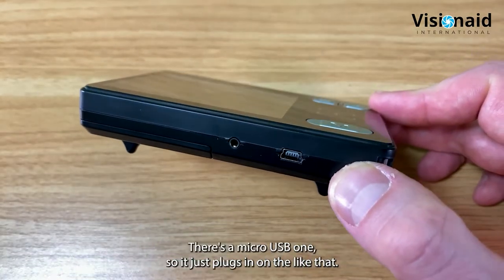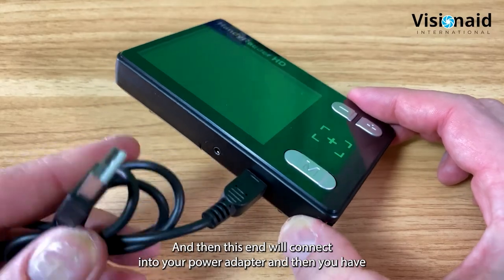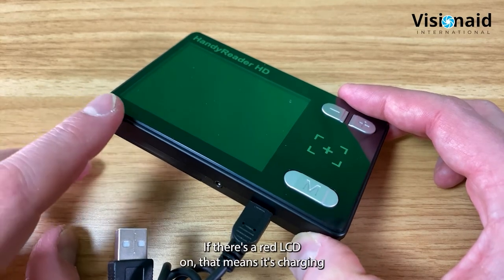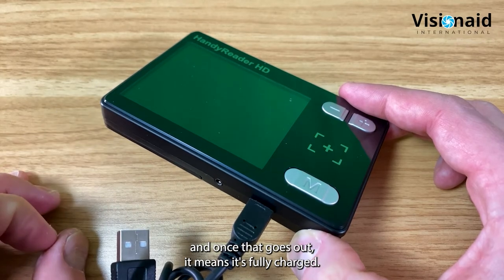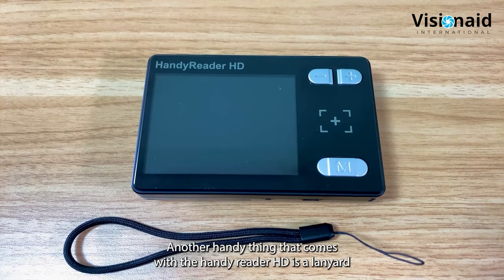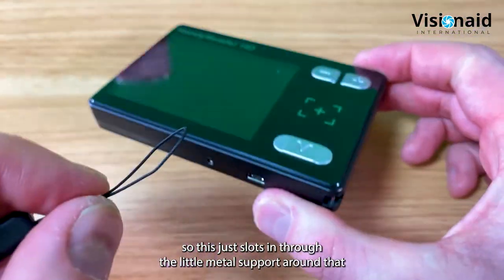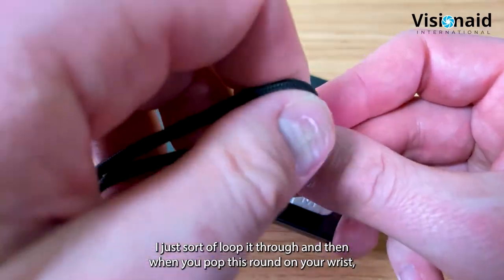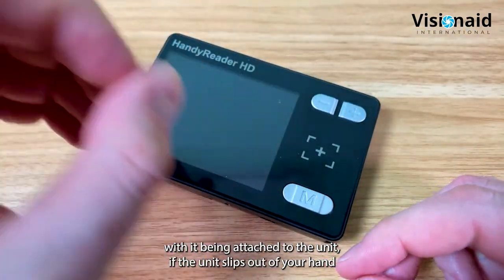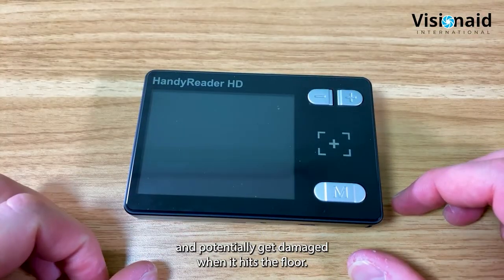The charging port on the bottom is a micro-USB connector. The included power adapter connects to the other end. LEDs on the bottom left corner indicate charging status - red LED means it's charging, and when it goes out the unit is fully charged. The lanyard slots through a little metal support on the unit, fitting like a normal wrist strap so if the unit slips from your hand while using it one-handed, it won't fall and get damaged.